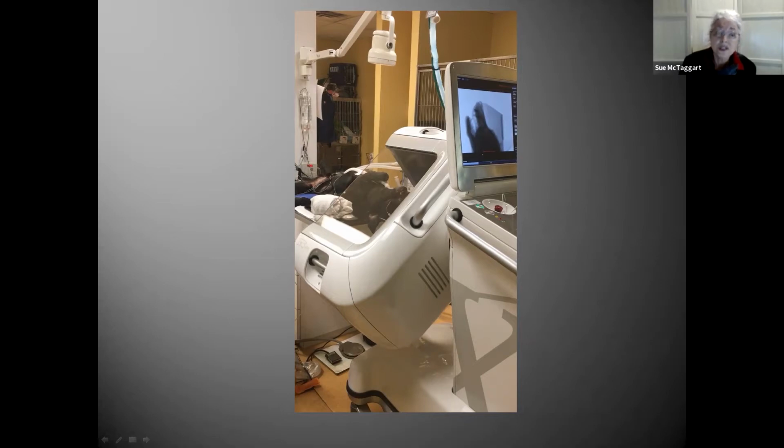So now that you've seen it, I'm going to present some cases where the surgical approach to a lesion or the treatment plan were guided by the three-dimensional imaging ability of this cone beam. And after seeing the kind of information we obtained from the scans, then I'll go through how we structure charges to the clients to easily cover the cost of this equipment and make a profit.